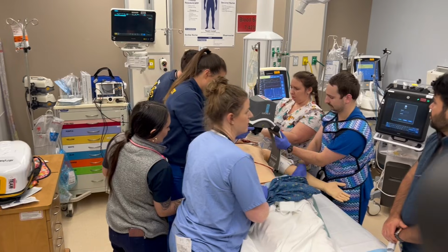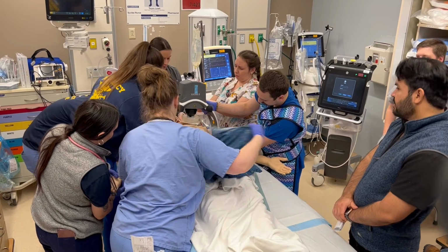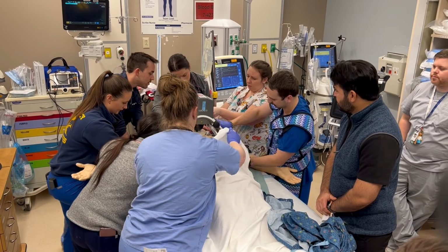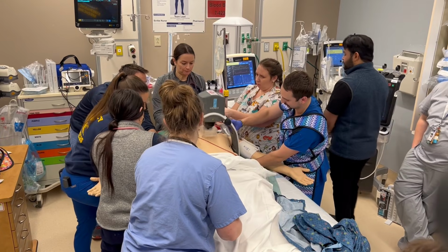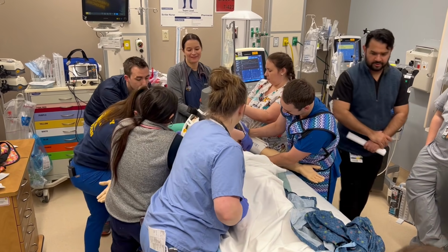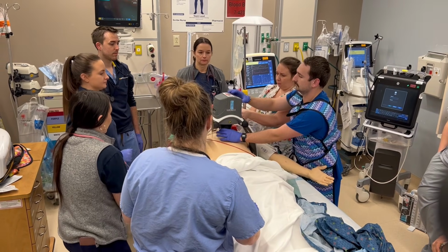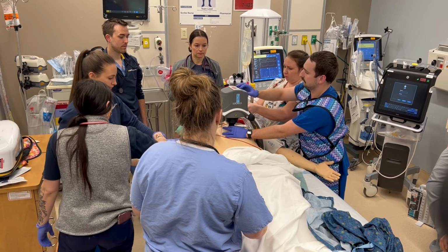I do not feel a pulse. Okay, let's continue. What's the rhythm? It is a 65, wide complex. Okay, all right, we'll continue. And when it's time to give the epi dose, we'll give the dose.